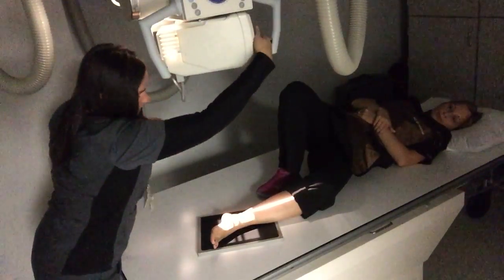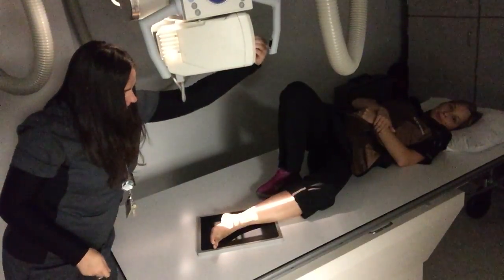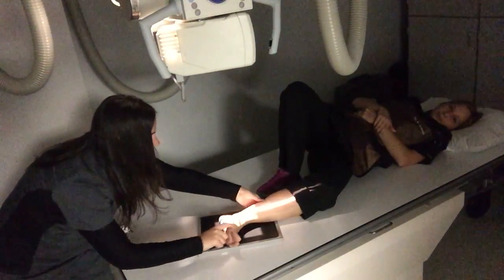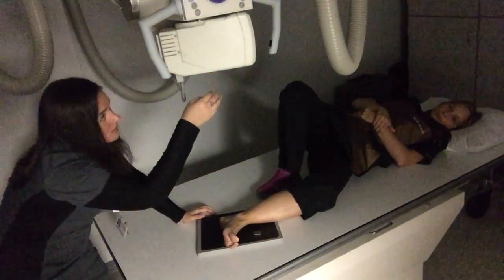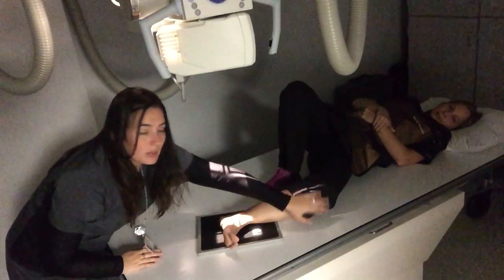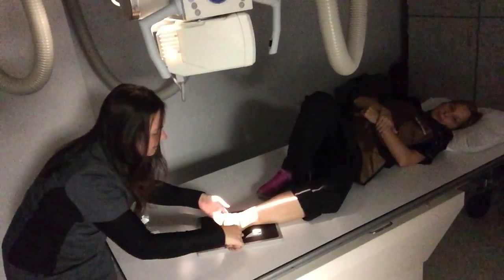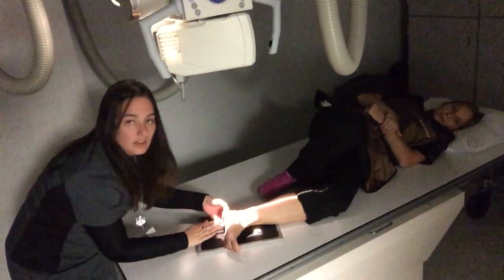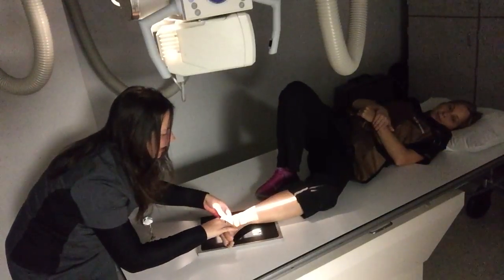Again, my button's on the other side. And again, I'm going to have her pull her toes back towards her, so that way I get a nice dorsiflexed foot, and I can see that I'm lateral. And like Mrs. Skaggs said for that foot, this is the same thing for the ankle. I'm not going to have her knee all the way down on the table. If I do have her rolled that way, I'm going to start to see this surface of her foot flat. And I don't want that. I want her foot nice and lateral as well.